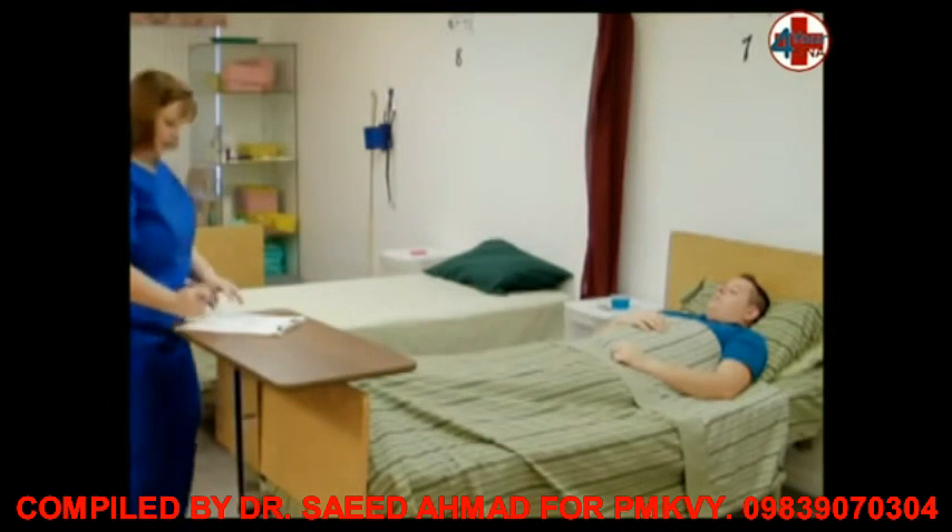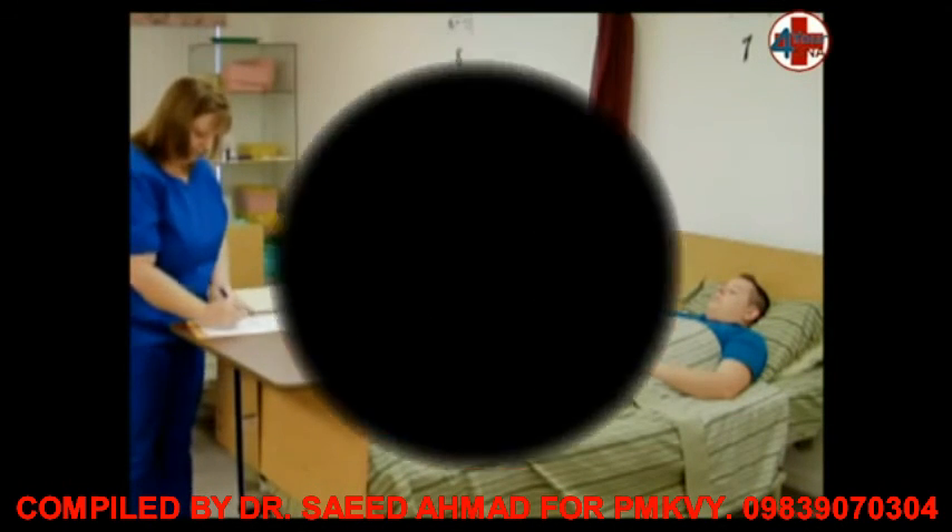Wash your hands. When you return, document the patient's blood pressure on the documentation sheet.